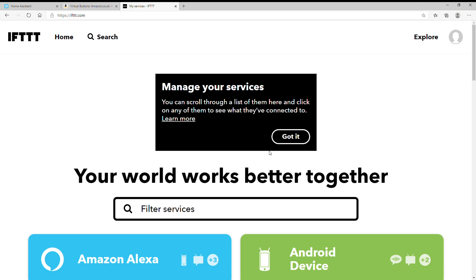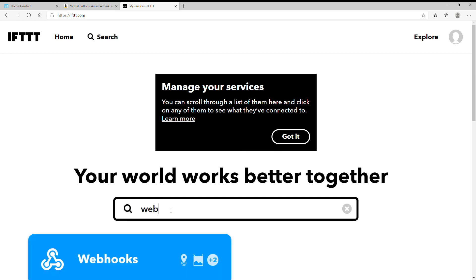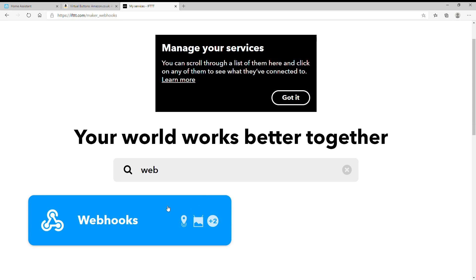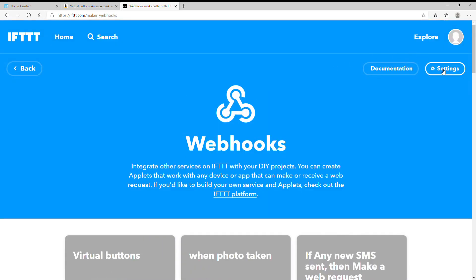The first thing you're going to want to do is launch IFTTT. If you don't already have an account, get it installed. Once you're in, go to webhooks — this is also known as the maker key; at some point they changed the name. Search for webhooks, click on it, and then go to settings.